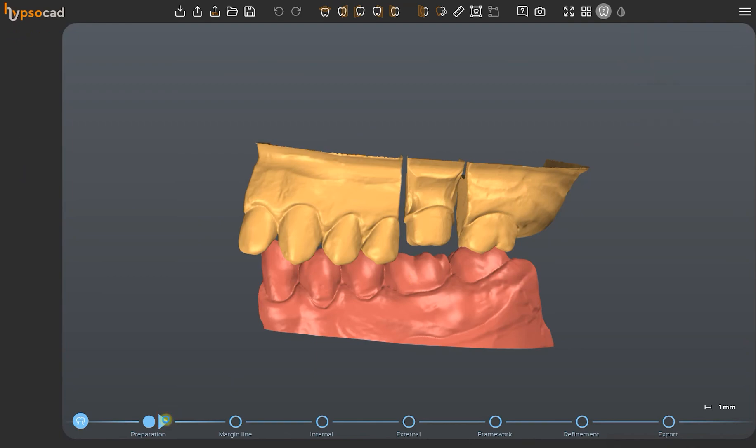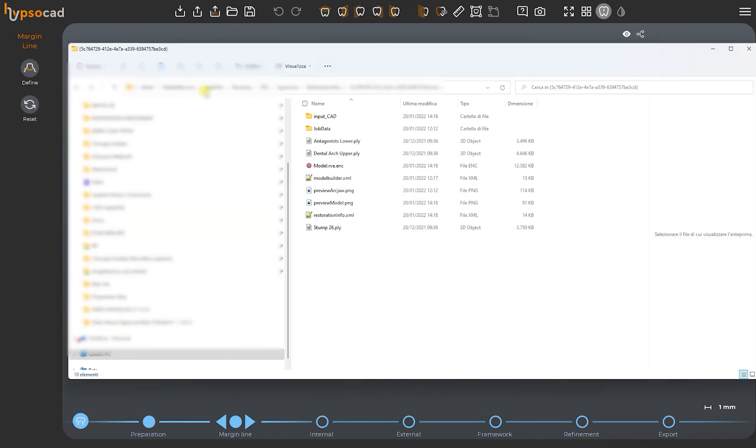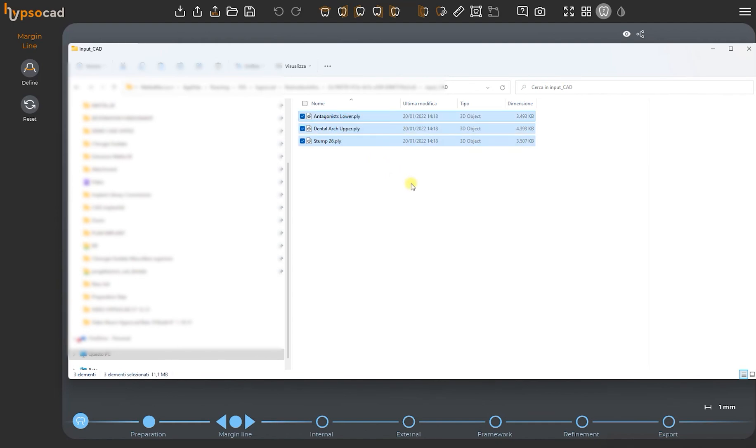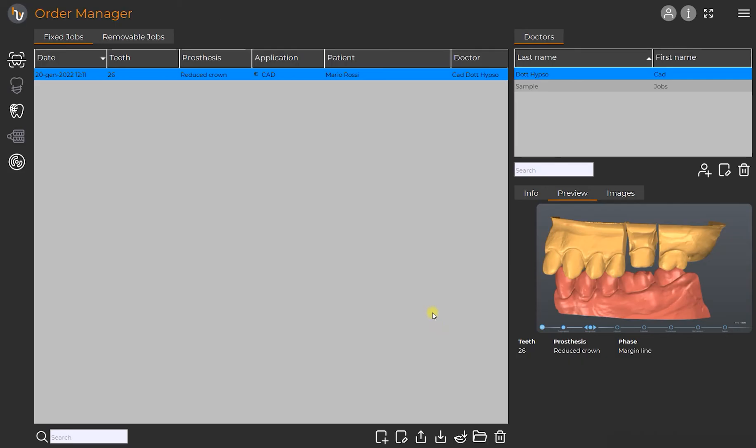When we proceed to the next step, HipsoCAD will automatically save the assigned meshes in the InputCAD folder along with all the editing made in Preparation mode. Once we complete the Preparation phase, we proceed on to modeling of the prosthesis using the CAD.